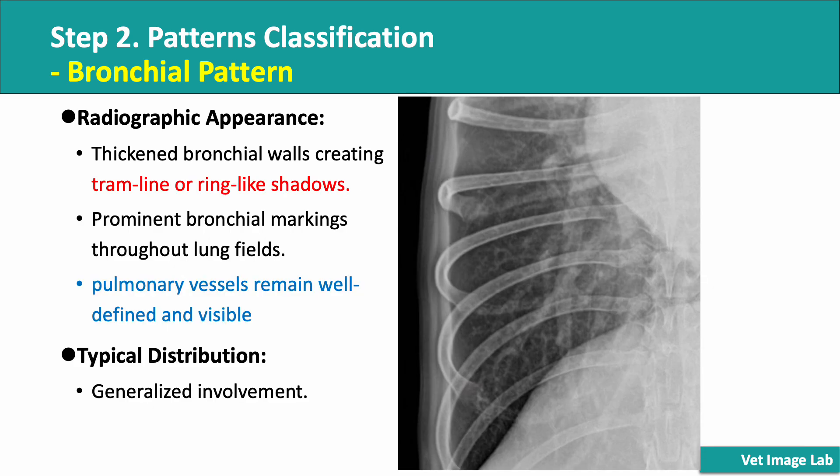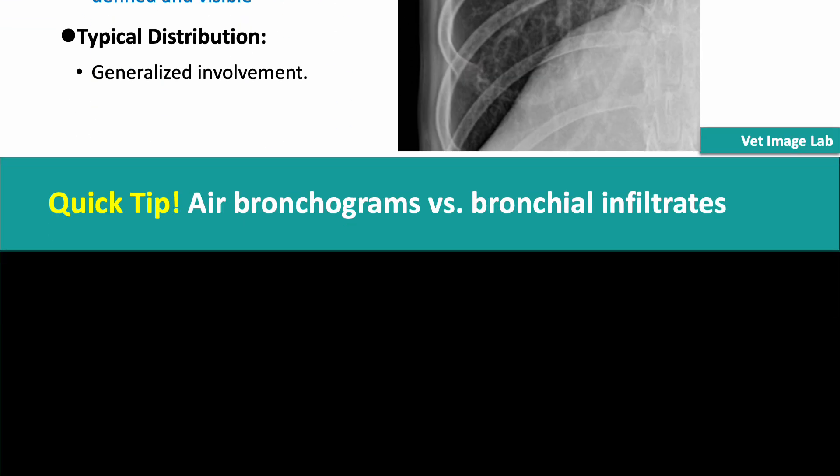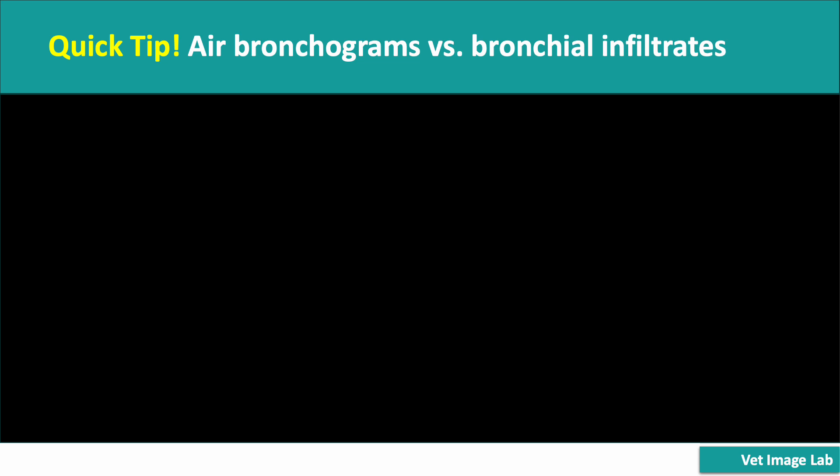In this magnified radiograph, you can see the bronchial infiltrates more clearly, highlighted by the thickened bronchial walls. Even though the airways are more prominent, notice how the pulmonary vessels remain well-defined and visible. Are you confusing the air bronchogram seen in alveolar infiltrates with the tramline appearance of bronchial wall thickening? It's an easy mistake to make, but don't worry, we're going to clear it up right now.